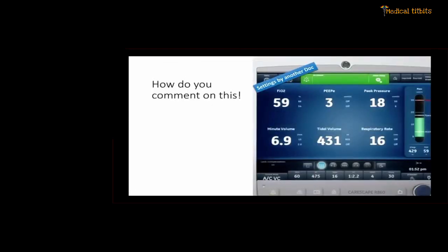And these are the settings by another doctor for our same patient in case 1, the post-cardiac arrest patient. This time he has gone for assist control volume targeted mode. How do you rate it? So you look at the monitor, FiO2, yeah. But you see PEEP is 3. Okay, set PEEP is 4, but it's around 3 to 4, which may not look suitable for a clinician when the patient is in pulmonary edema.